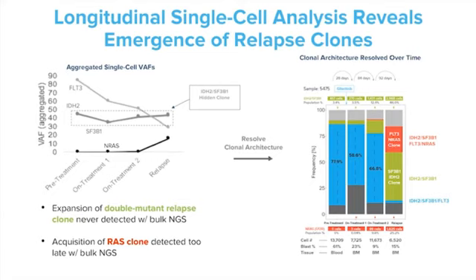But most impressively, you can see the drug-resistant NRAS mutant clone is actually not observable pre-treatment, but is able to be resolved very soon on treatment. At only 28 days on drug, we were able to see that 0.04% of the cell population at that time was actually made of the eventual red relapse IDH2, SF3B1, FLT3, and NRAS mutant clone.